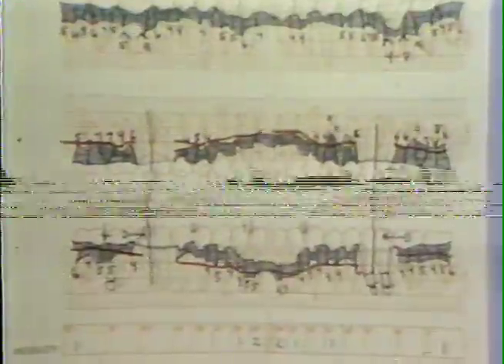The periodontal status is indicated on this chart. The free gingival margin is related to the cemento-enamel junction and the area between the free gingival margin and the bottom of the crevice or pocket is marked in blue.